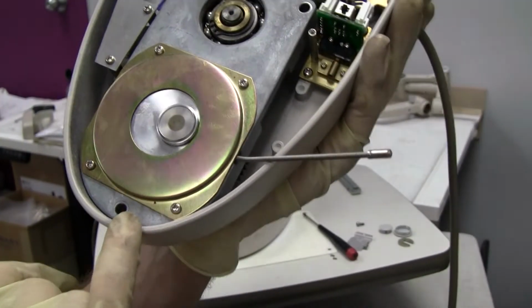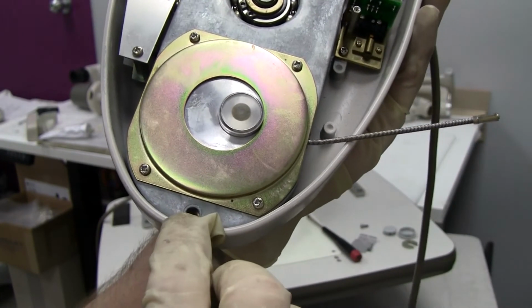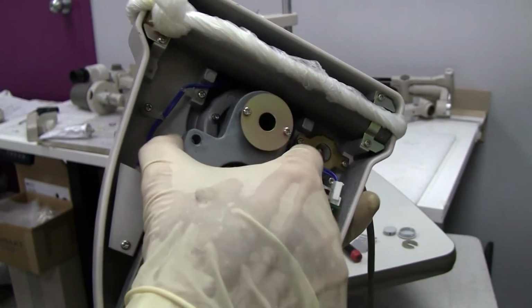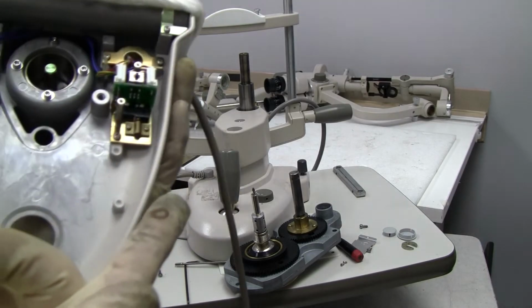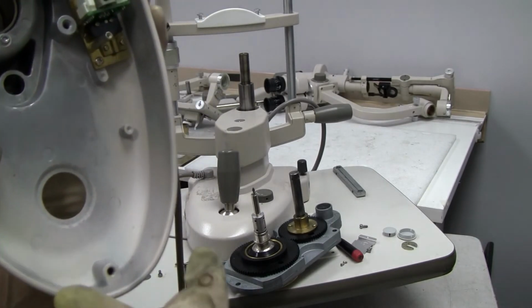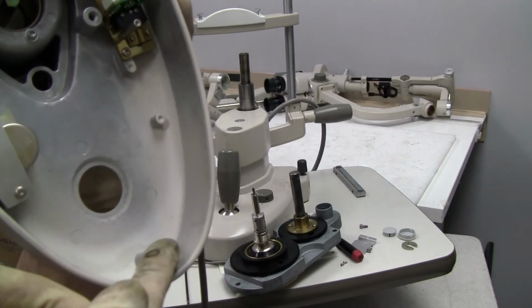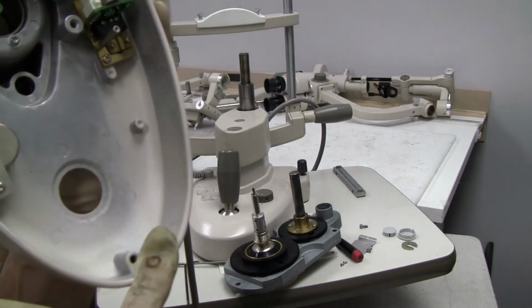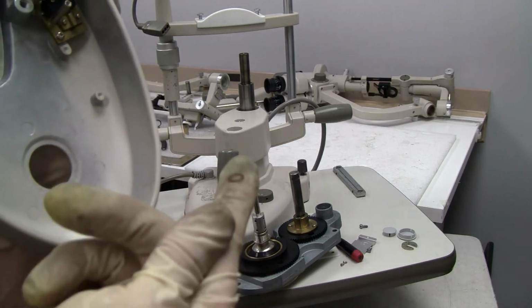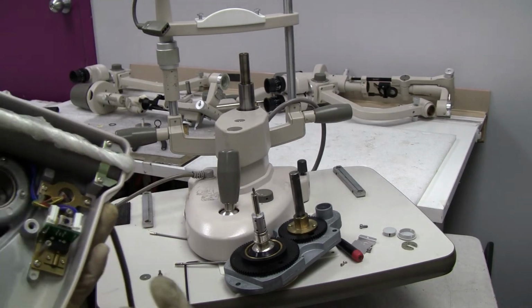Now, out here at the base, you have a smaller screw right here. And underneath that, there's a small washer. It's this little washer. It's going to go right there. It's a little spacer washer that's very important for the alignment. So make sure that washer is in there. It's a very thin brass washer, but that's got to be in there when you put it back together.